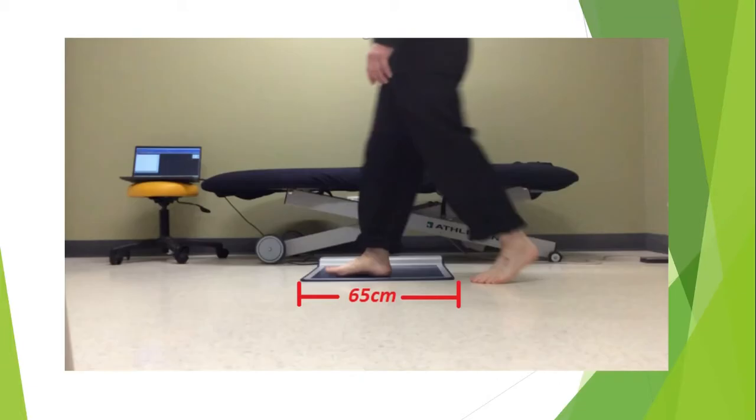Today we're going to be looking at doing a gait assessment in a standard clinic room, which is about three and a half meters by three and a half meters. We can't always access a hallway to do a gait assessment because it's a shared area. And with the new restrictions with COVID and the like, we don't necessarily want to be in a mixed area. We want to stay in the confines of our clinical room.